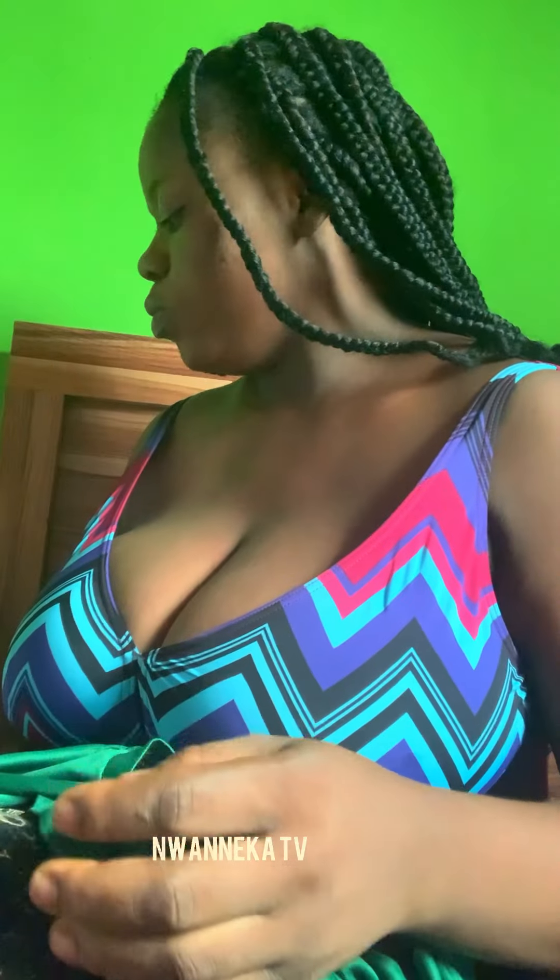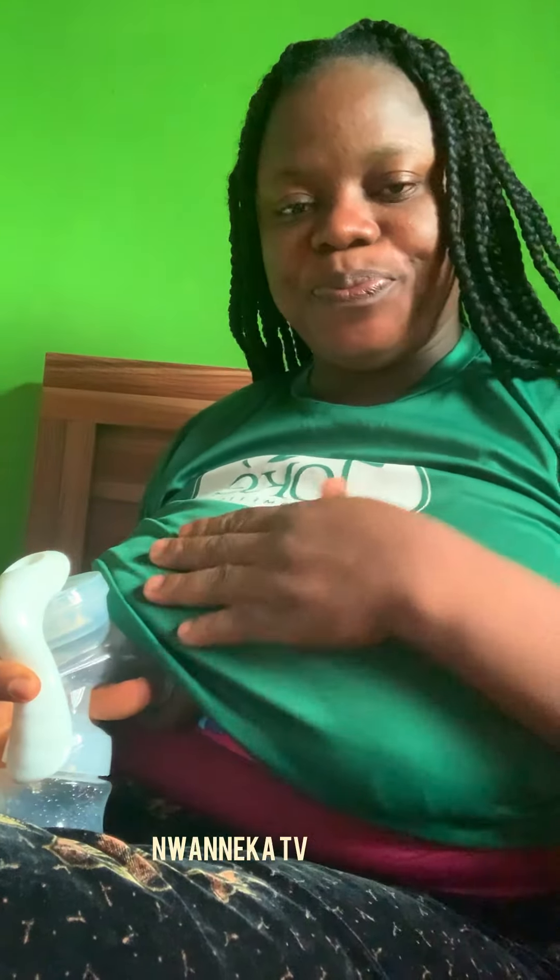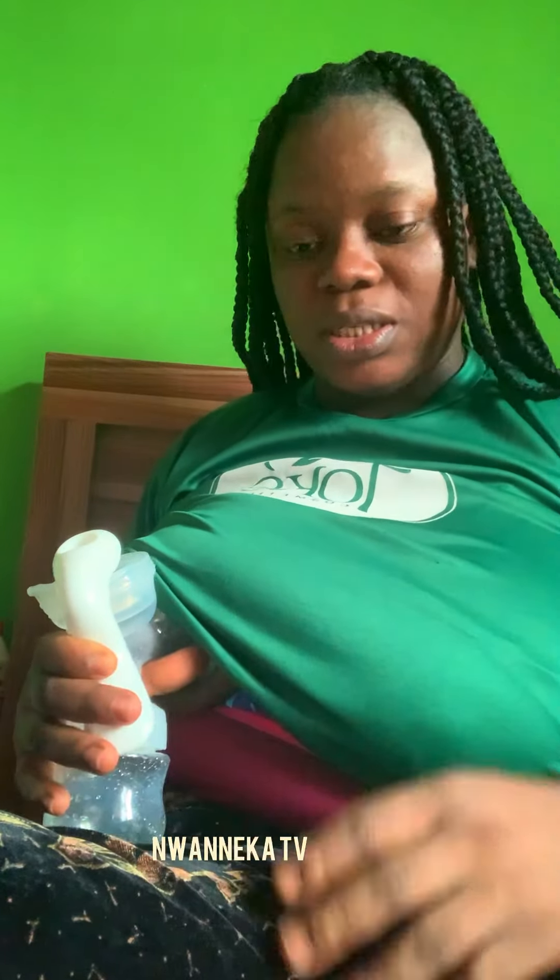So many of you demanded the using part of this breast pump — this is the Avent manual breast pump. So many of you demand for the using parts, I want to show you how to use it. This is my feed, that's where I'll pour the breast milk. So I'm going to show you — just hold on. This is how to use it: the nipple will be inside the part that has a mouth opening like this.